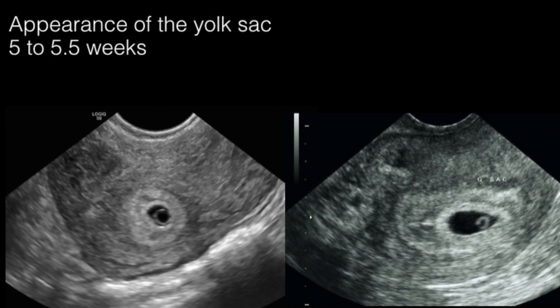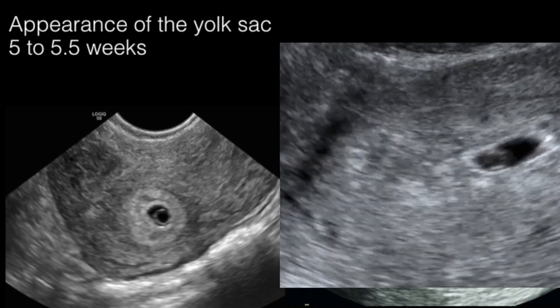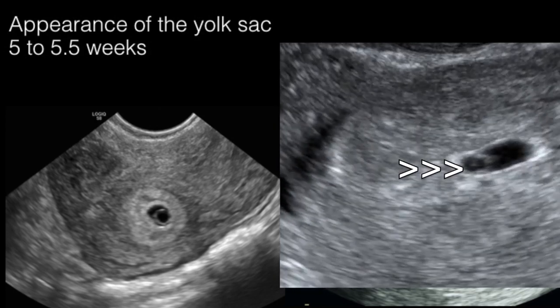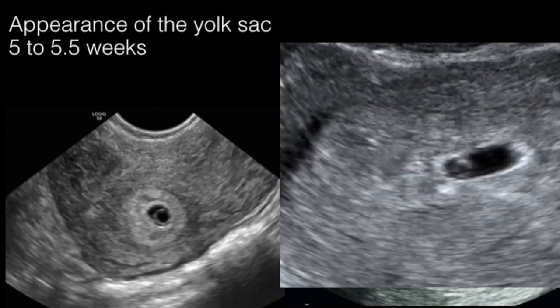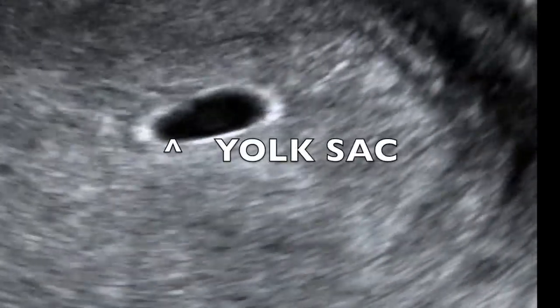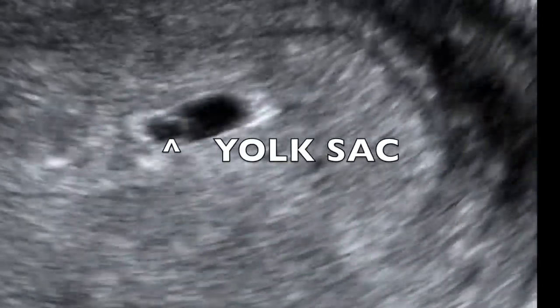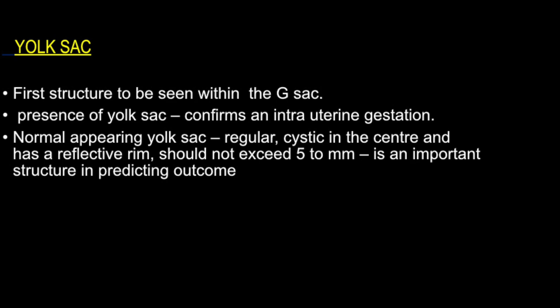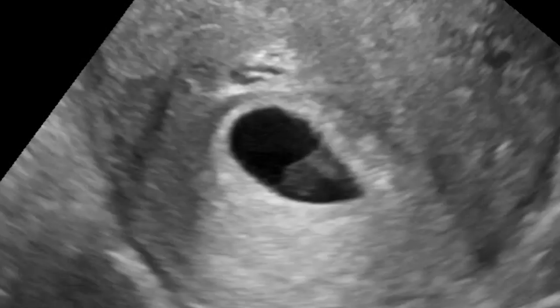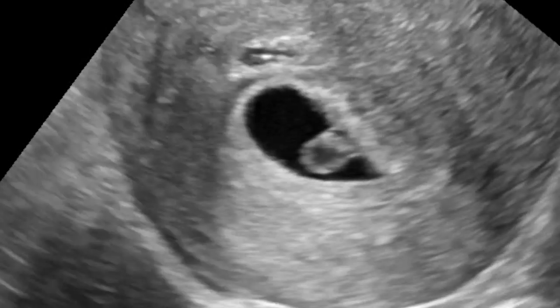The next sequential finding is the appearance of the yolk sac by around five to five and a half weeks. The yolk sac is an important structure — once identified, it confirms an intrauterine gestation. It's a regular cystic structure with a reflective rim, usually does not exceed five to six millimeters, and is an important structure in predicting outcome. Next to appear is the embryo at around five and a half to six weeks, seen closely juxtaposed with the yolk sac.